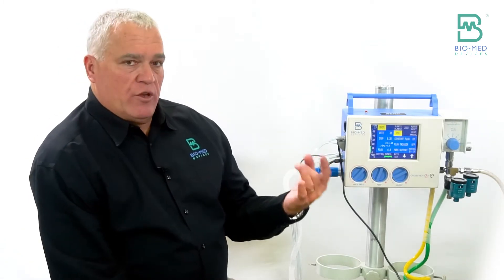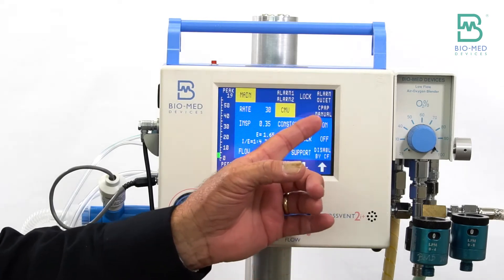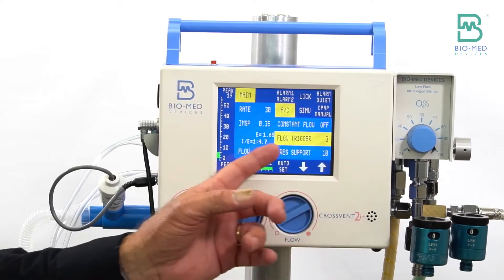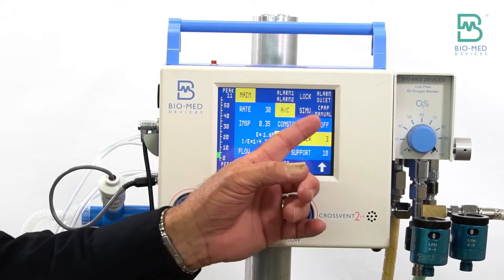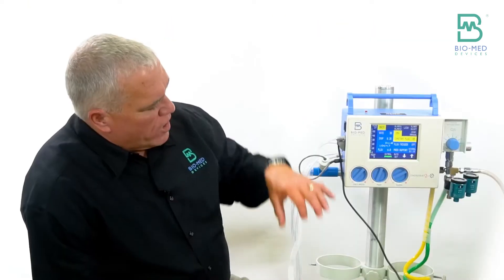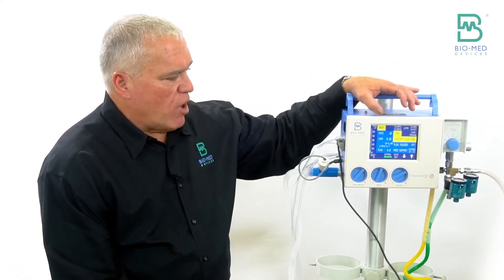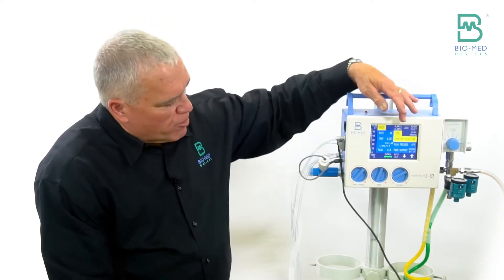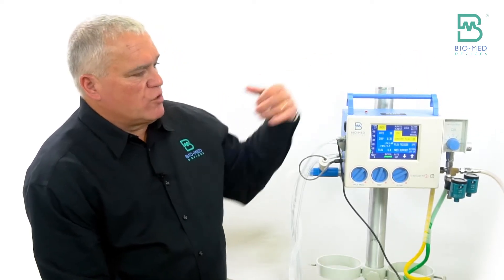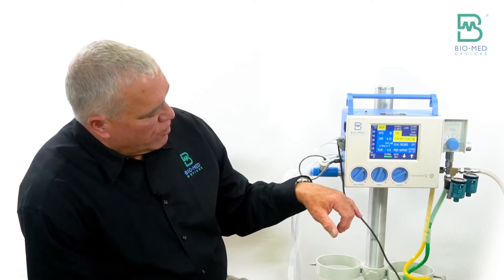You can use the vent in two different modes: constant flow, in which case flow trigger is off; or if you have the flow trigger installed, you can use flow triggering, in which case constant flow is off. Typically when you're going to pick up patients on transport or initially put them on the vent with an intubated patient, you'll probably want to use the flow trigger. But for ease of learning from the old vent, I'll go ahead and show you the constant flow mode.